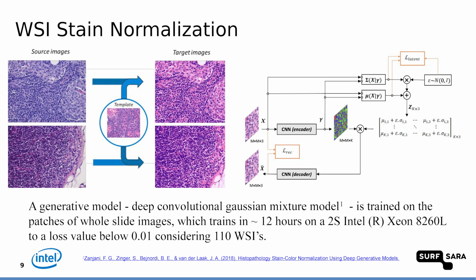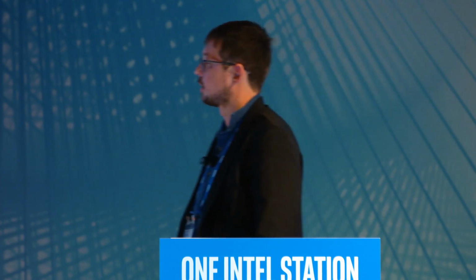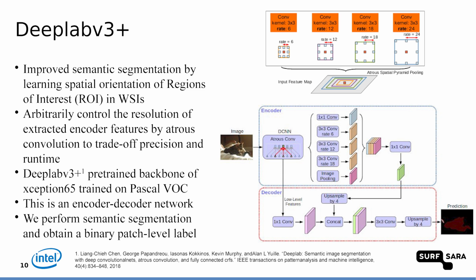After doing that, now I'm going to talk about the learning architecture that we use. We use DeepLab v3, which is quite famous. It's made by Google. The feature that makes it appropriate for segmentation is exactly the thing on top: the atrous convolution, or dilated convolution. It's like a sparse convolution, a convolution with holes. You don't have consecutive filter values one after the other, but they are spread out with the ratio you see on top, the rate. So they are spread out by 6 or by 12 or by 18 and so on.